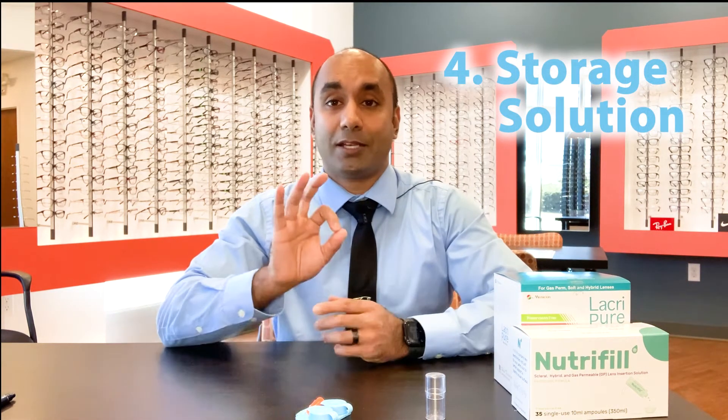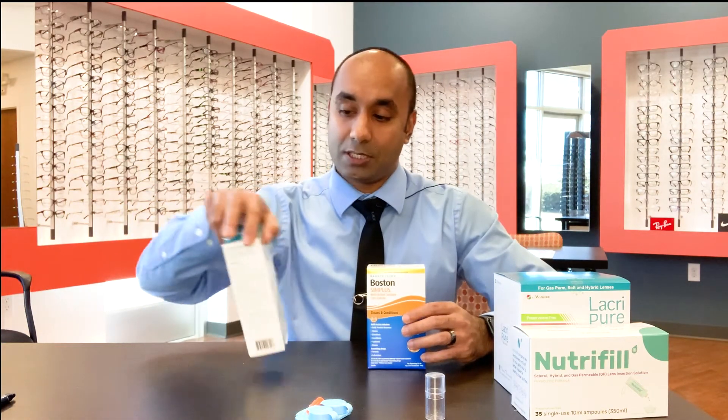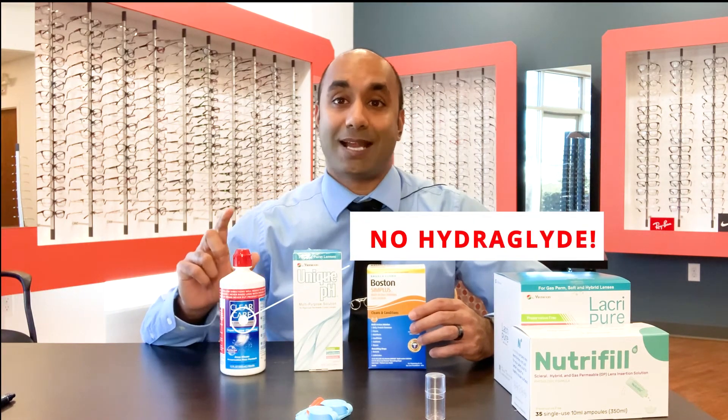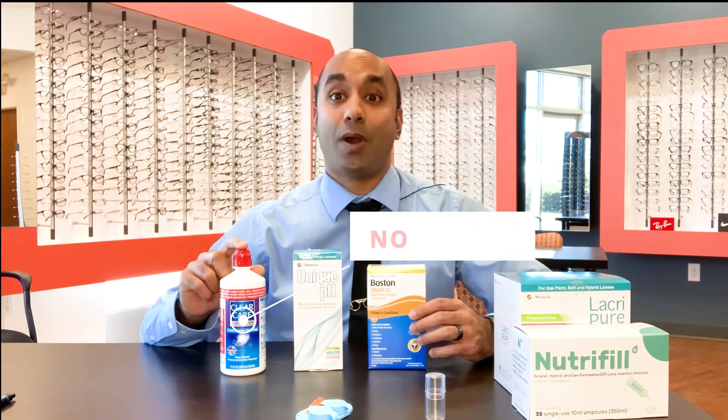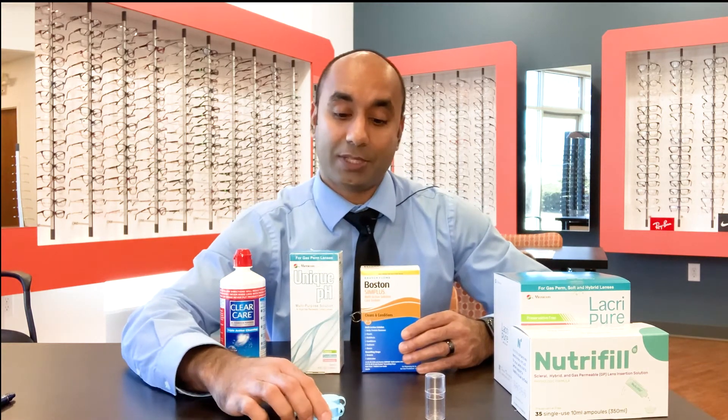The next thing you're going to need is a storage solution. There are three options: Boston Simplus, Unique PH, or ClearCare. If you're using ClearCare, make sure it does not have HydraGlide and that you don't have HydroPeg on your lenses. If you don't know what HydroPeg is, talk to your doctor or talk to me — we'll go over that with you. Unique PH and Boston Simplus are no-rub solutions; you fill the case with them and store the lenses overnight. So that's the basic.